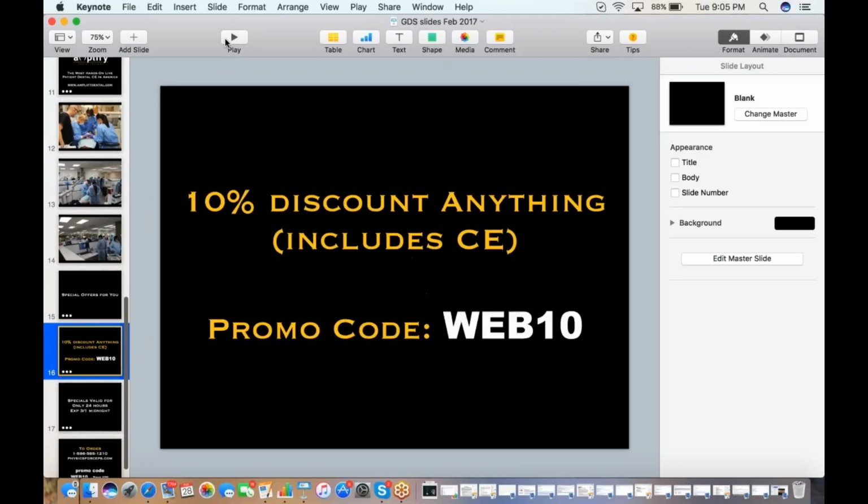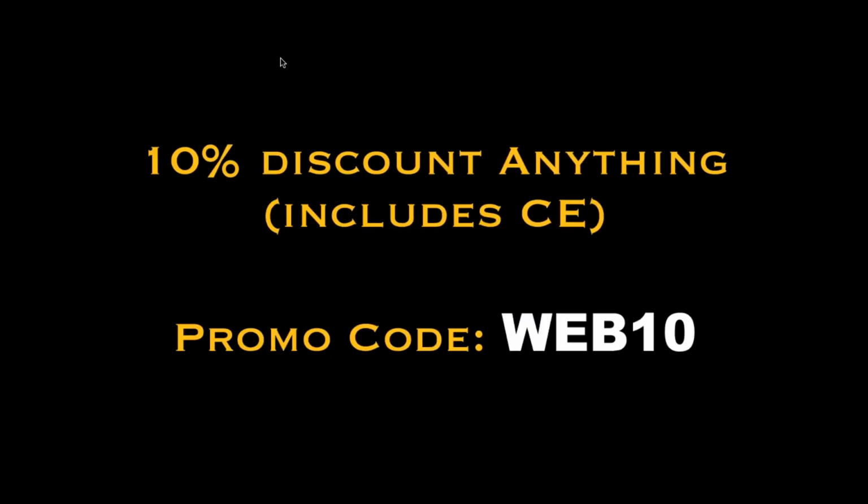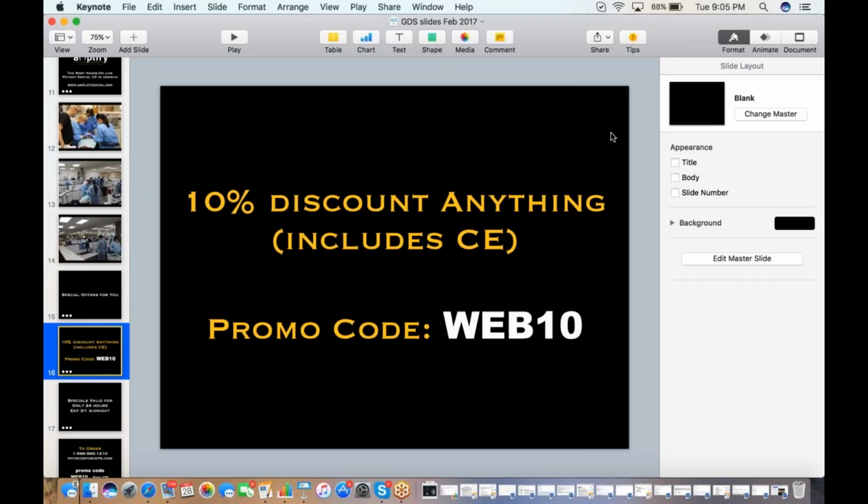We want a D2 type of bone, which is the most favorable for implants, because we still want blood supply to get to the area. We don't want it to feel like we're drilling through a Coke bottle, and we also don't want it to feel like we're drilling through styrofoam. So I urge you to try the Dentin graft material, or to come to the residency and try it on our patients that come to this school for free dentistry, to allow you to get the ideal training that we offer to our patients.